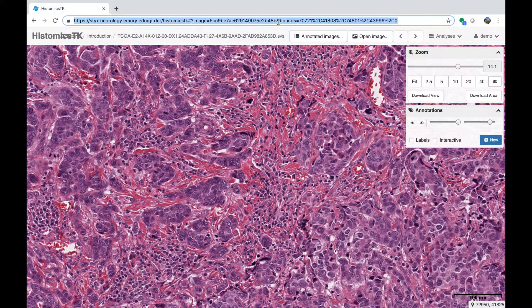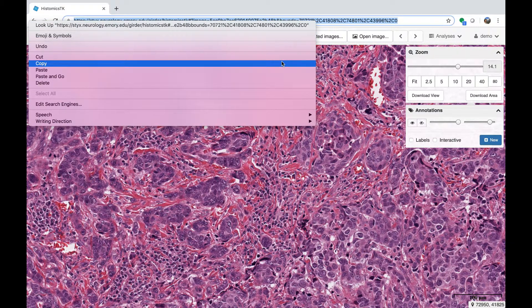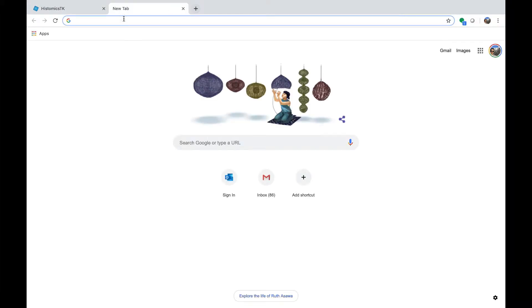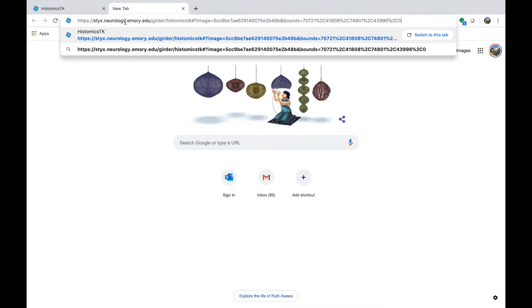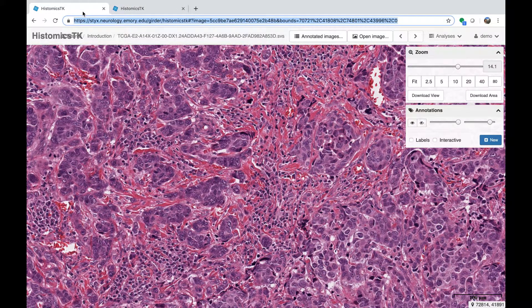Everything you need to know about a view is encoded in the URL, and that updates as you move through the image. You can copy a view and send it to someone who has permission to access it, and as long as they have permissions, they'll see the same view just using the URL. This is helpful when you're trying to save views for yourself or to share views with other people.